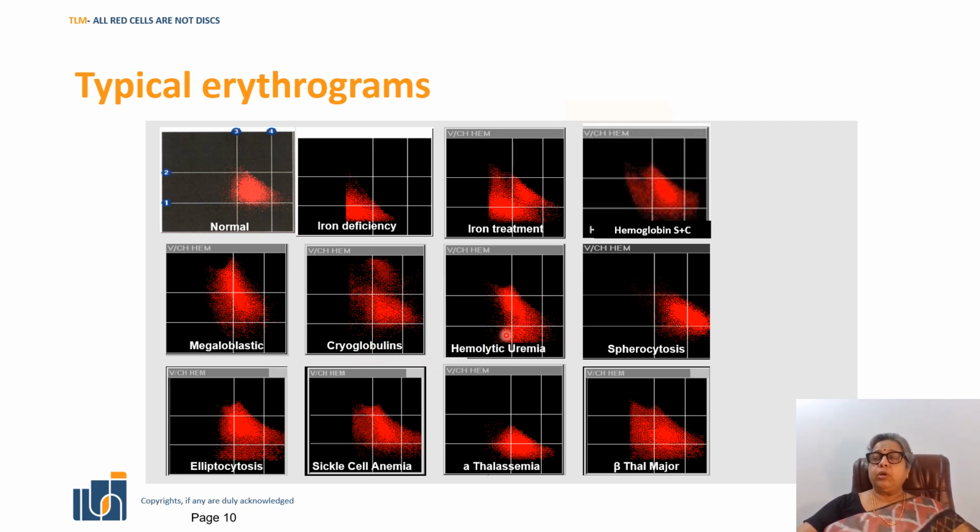HUS will give you some schistocytes, therefore there might be a move to the right, and it will give you microcytic spherocytes. Spherocytosis shows a movement to the right. Elliptocytosis will give a broad-based scatter. Sickle cell anemia also moves to the right. So when you have these erythrograms from your cell counter, you'll be able to give your diagnosis faster, and the correlation level is more objective than subjective.